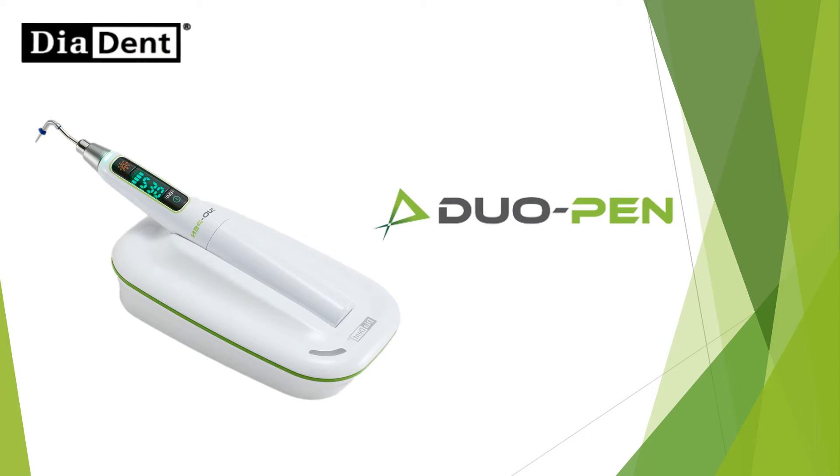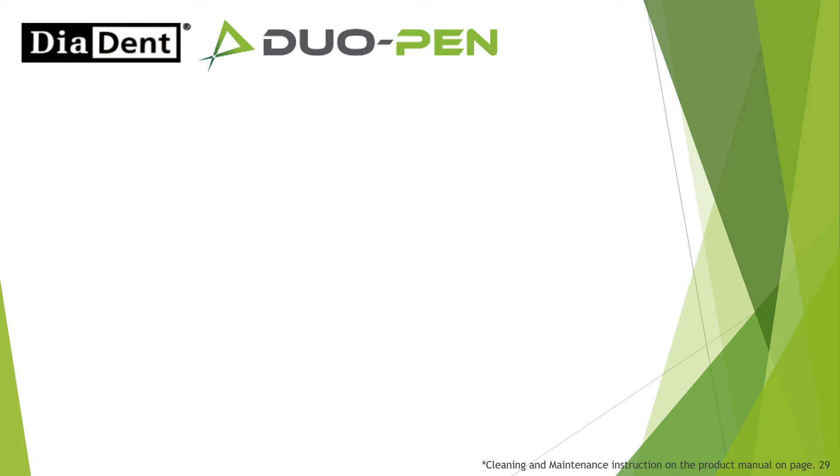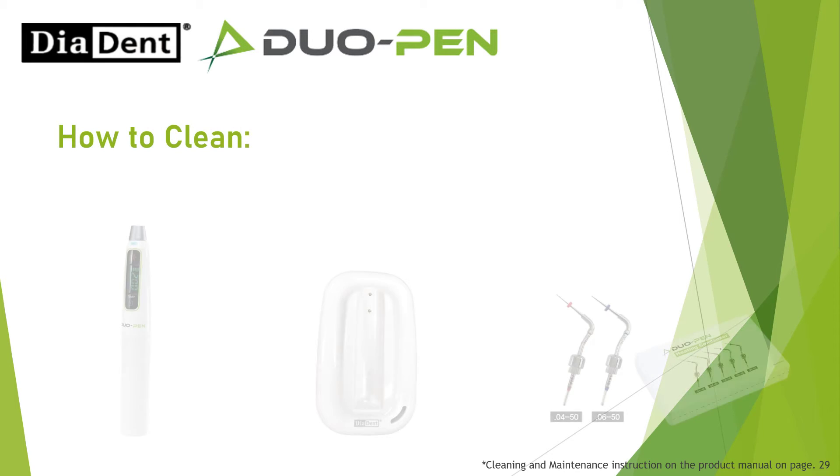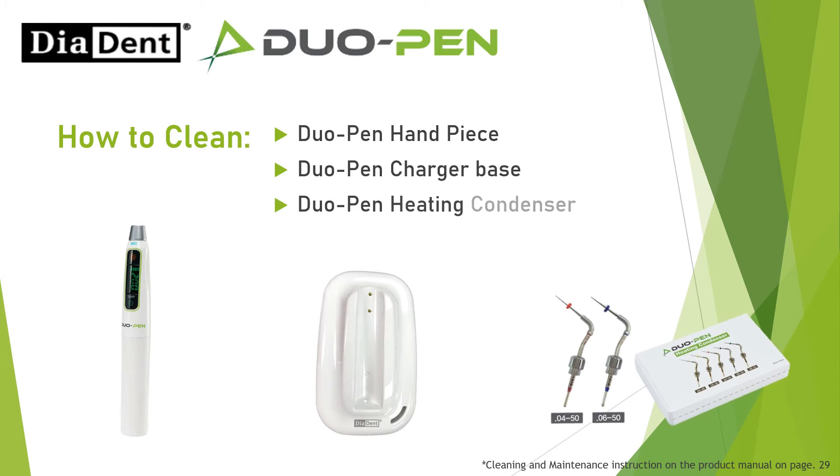Duo-Pen cleaning instructions. How to clean: Duo-Pen handpiece, Duo-Pen charger base, and Duo-Pen heating condenser.